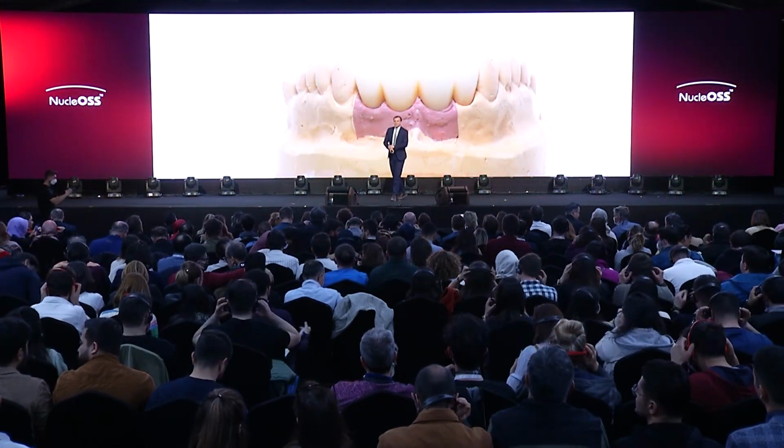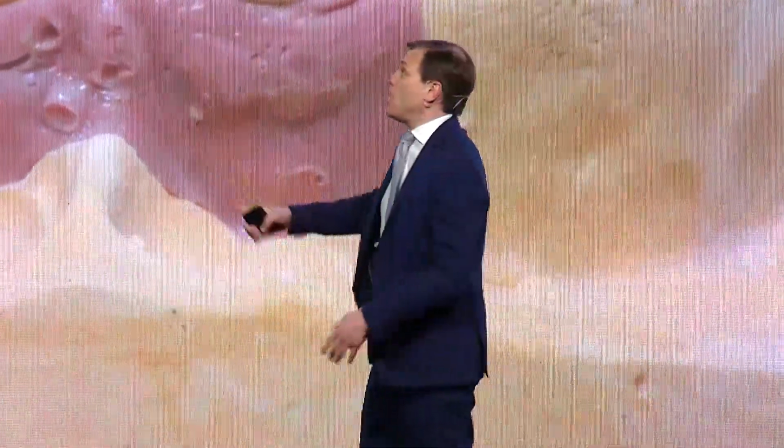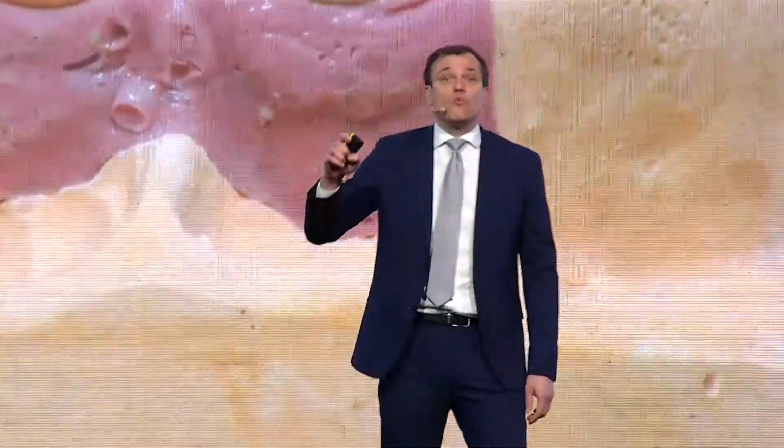Welcome back to the second part of zero bone loss concepts. And now we're gonna discuss how to keep the bone stable. First, in the first part, we talked about factors which are important to develop, biological factors and implant design factors. Now that's not all. Now we're gonna discuss, okay, from a prosthetic point of view, what we need to keep in mind in order to keep that bone stability.